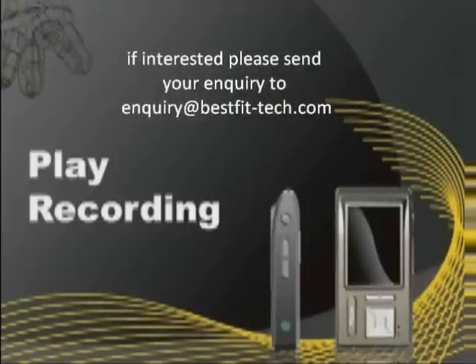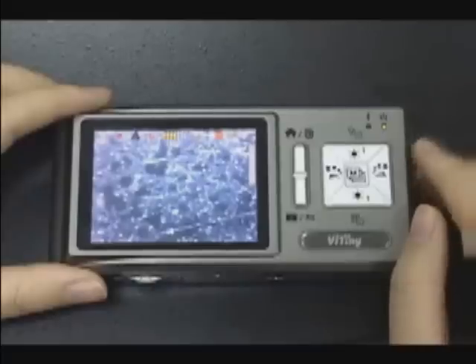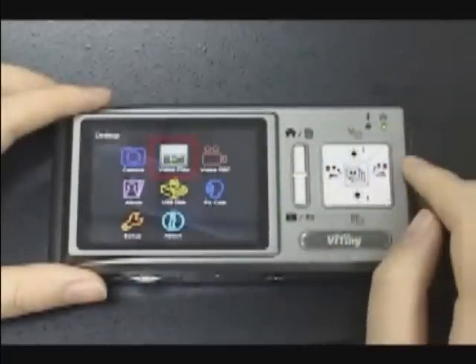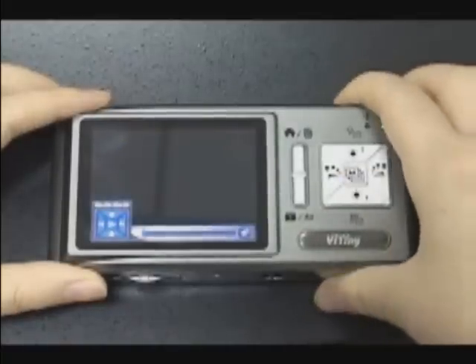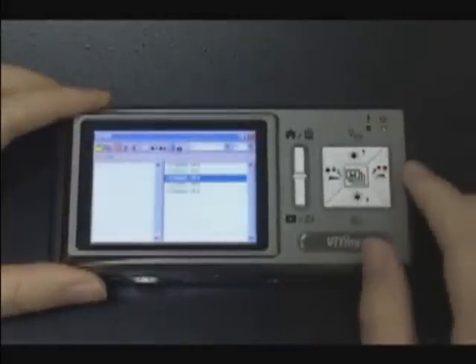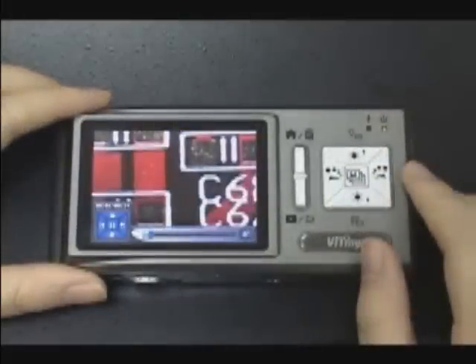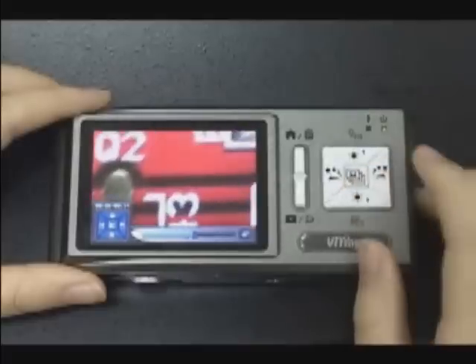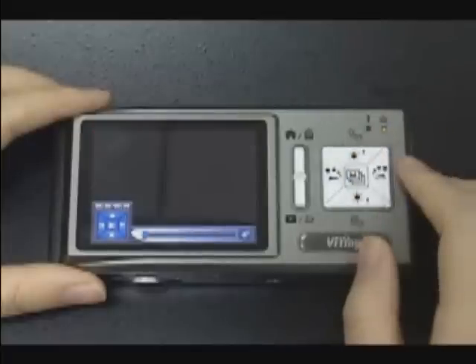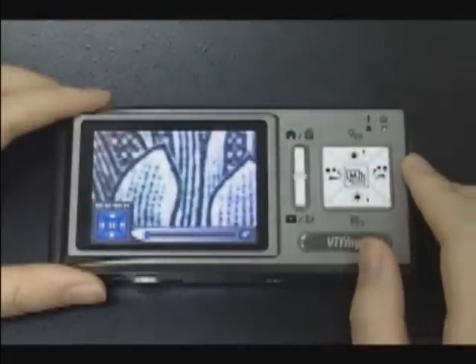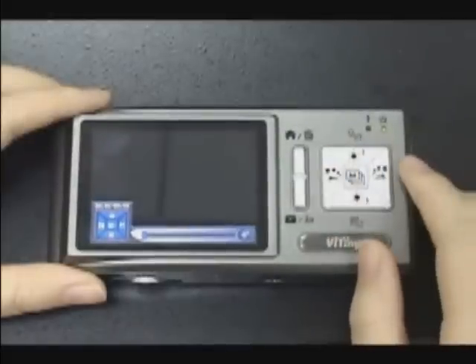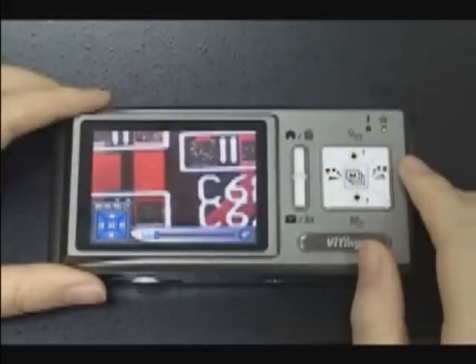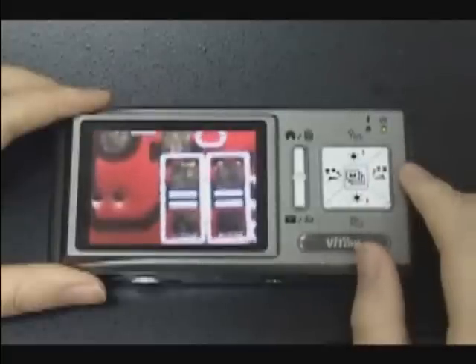Play recording. Select video play and press the middle button, then press the snapshot button to enter the chapter. Choose the video file you want to play. Press the bottom middle button to pause video, press the bottom up button to stop video, press the bottom right button to play the next file, and press the bottom left button to play the previous file. Press the bottom button to hide the control panel.